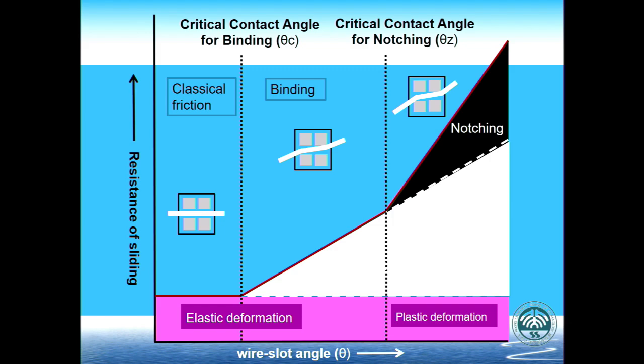Kusy points out the optimal sliding happens around this point, where theta is roughly equal to theta c.